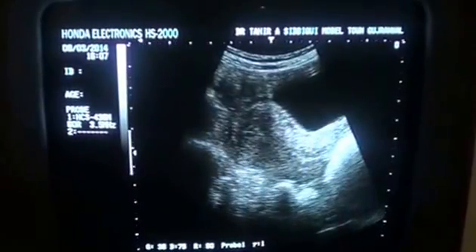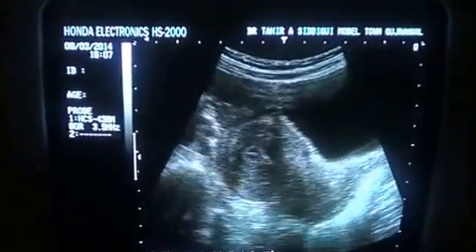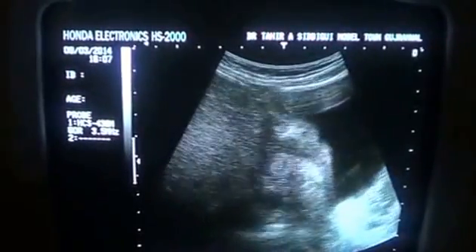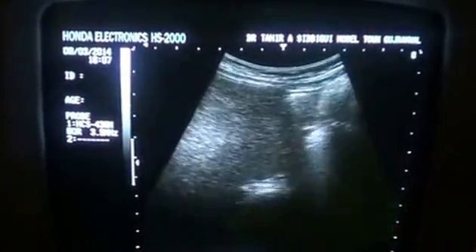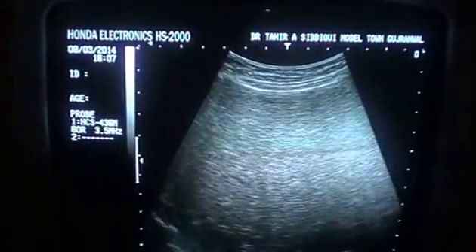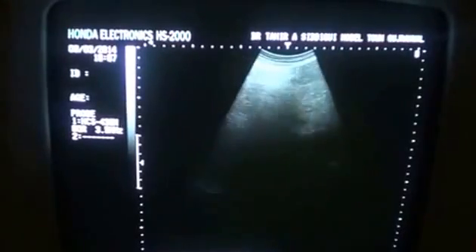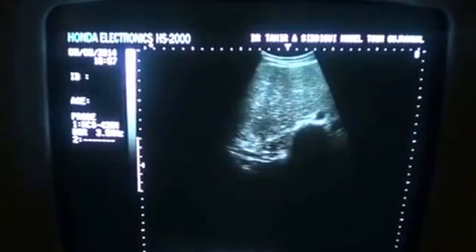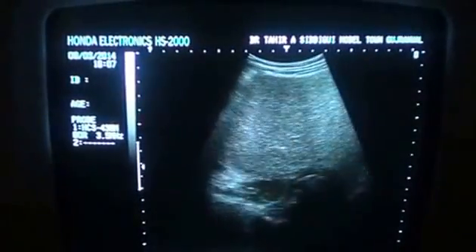She, having 2 kids, is only 30 years old and has a large heterogeneous mass that extends up to the right hypochondrium.